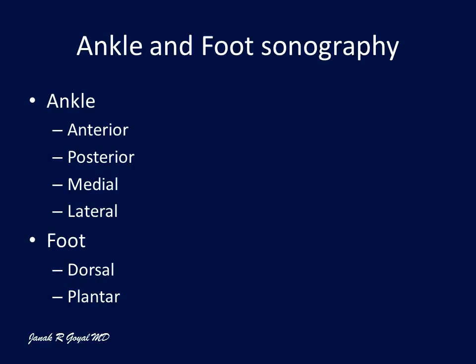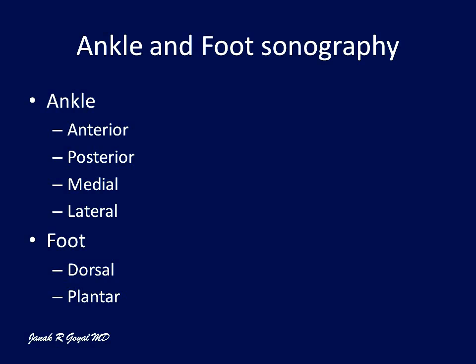The examination of ankle and foot is focused to the structures based on clinical impression. The systematic technique of ankle and foot examination is for learning and teaching purposes only. The ankle is examined from four quadrants: anterior, posterior, medial, and lateral, and the foot is examined from its dorsal and plantar aspects.